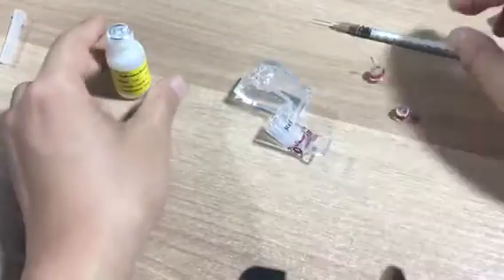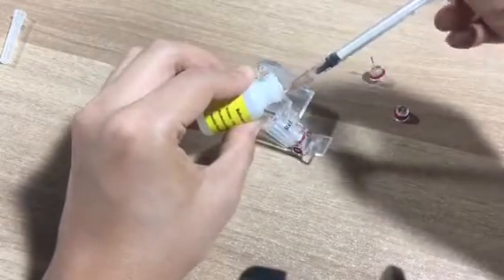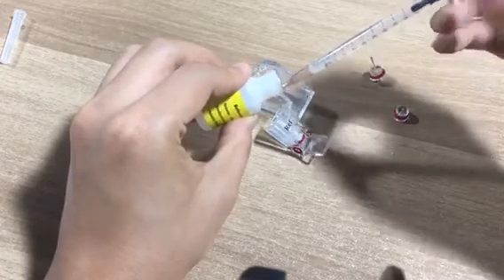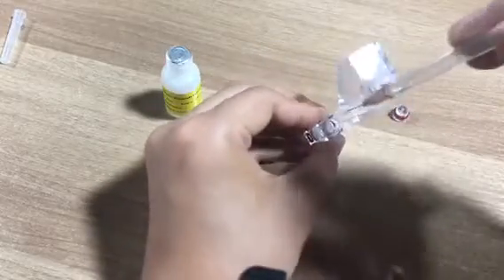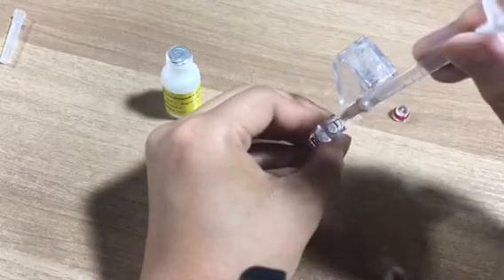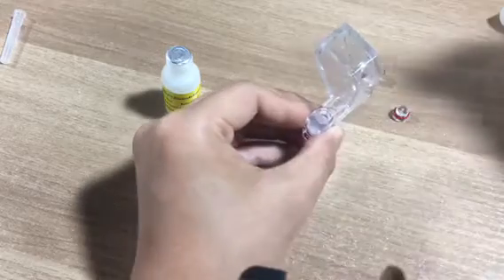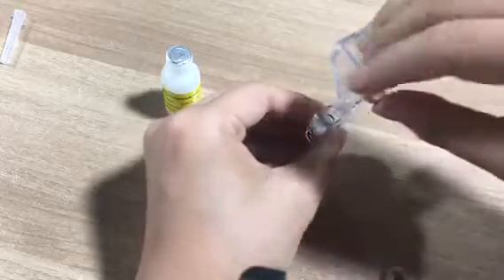Then we use a syringe to take out some reference electrode solution. Then we add here first. Please take care — do not poke the membrane. When it is near the surface, just close it.